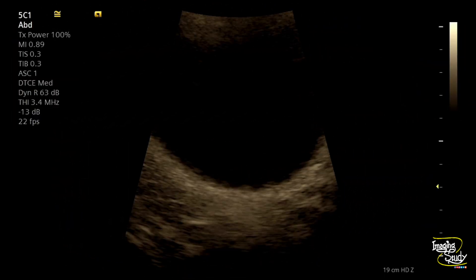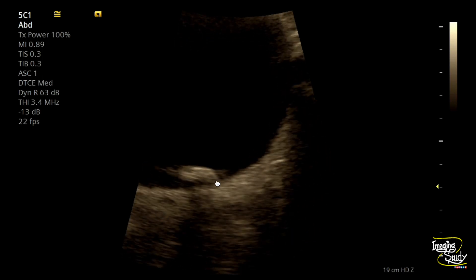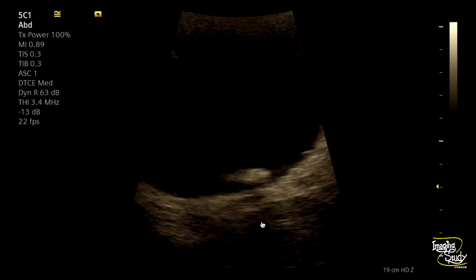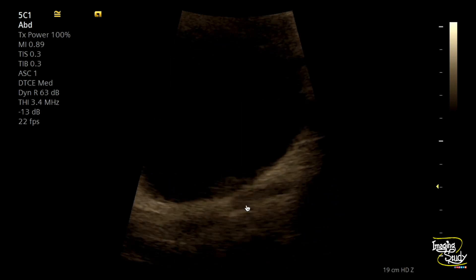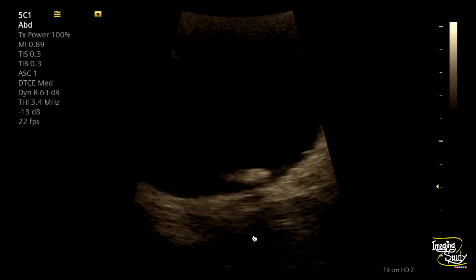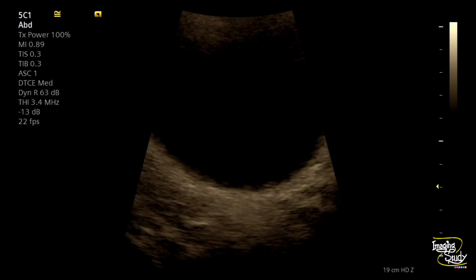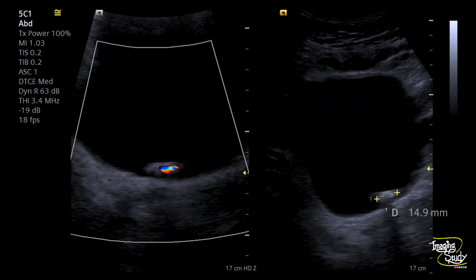We have magnified the image and you can still see this hyperechogenic structure within the urinary bladder lumen. Now you can see the acoustic shadow. We have applied color Doppler and you can see the twinkling artifact posterior to this stone. On the right image, the stone measures around 15 mm.